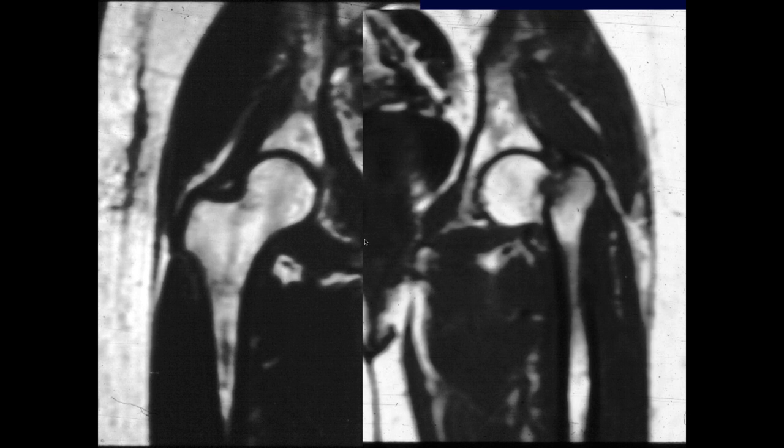Is that the left side? It's the left side that hurt. Yeah, so it's almost like a completely displaced fracture. So the situation here is that probably in between the CT and the MR scan, the patient completed the fracture and they got a displaced fracture.